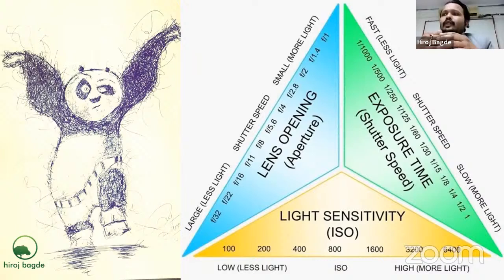So I just want to control everything so that every time I click, I will get the same image with the same exposure cycle. So I need to create that cycle whenever I am going to go for dental photography. So I'll go back again.